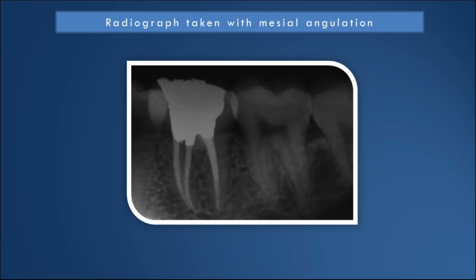Before learning how to differentiate buccal from lingual canals, let's try to identify the canals in this radiograph, that is the obturation.